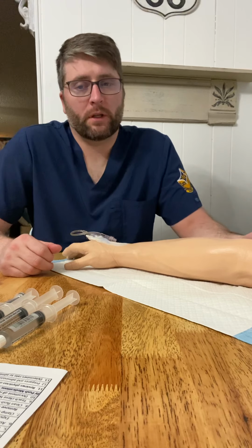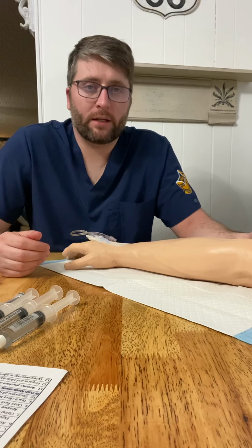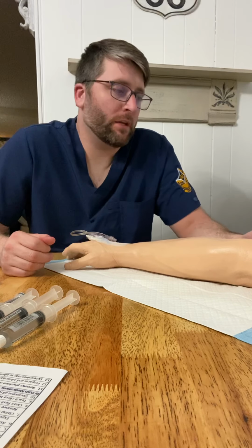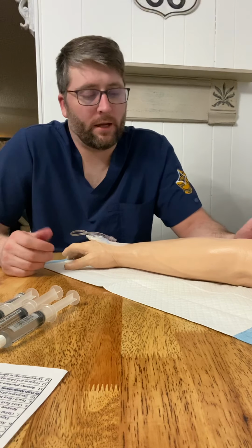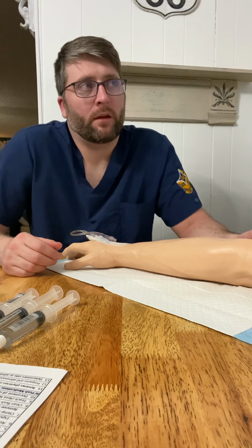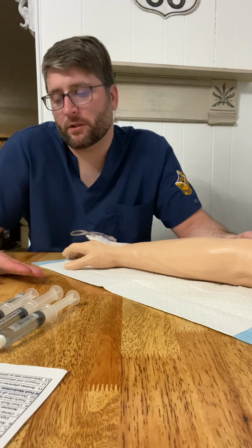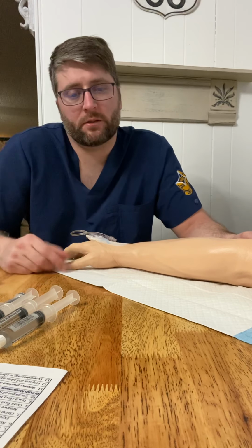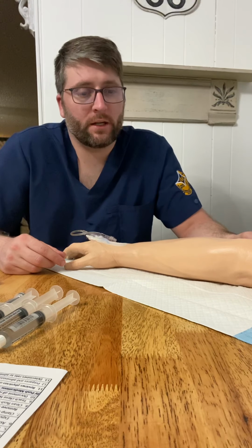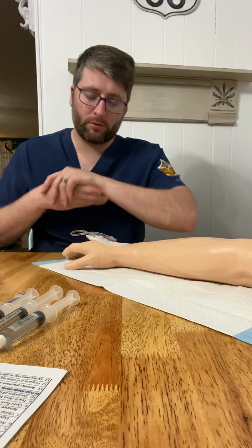We're going to follow all appropriate precautions and do our hand hygiene. We are going to check our MD order and our MAR. We're going to identify our patient with 2 identifiers. Hey, Ivy Arm, how you doing? Can you tell me your name and date of birth? My name's Ivy Arm, and my date of birth is 0101 of 2000, which matches my orders, matches my MAR, and it matches her wristband. So we have our 3 checks of medication administration. So at this point, we are going to wash our hands.